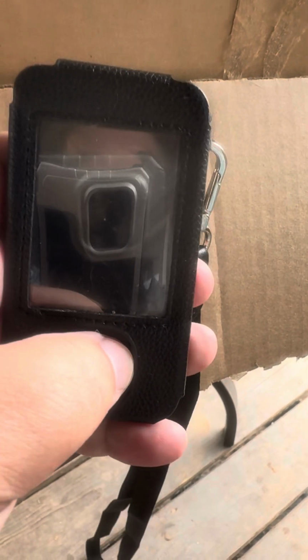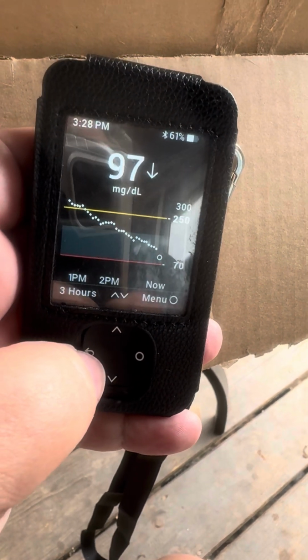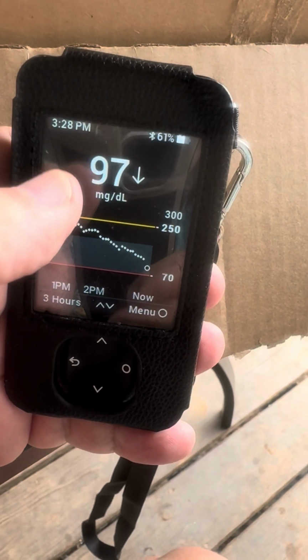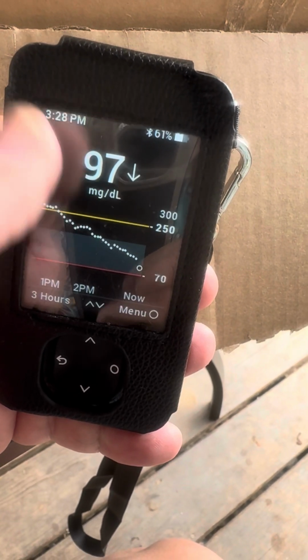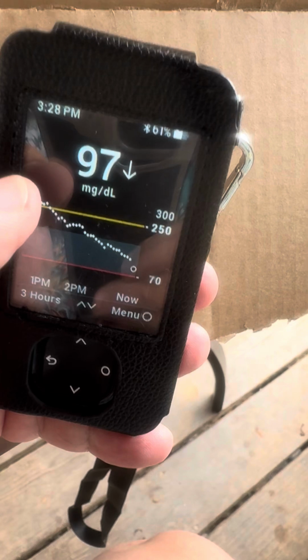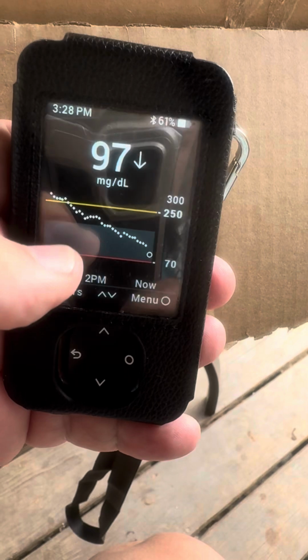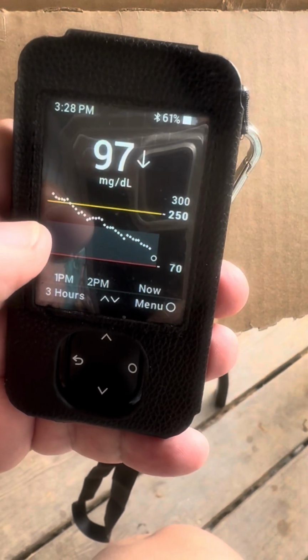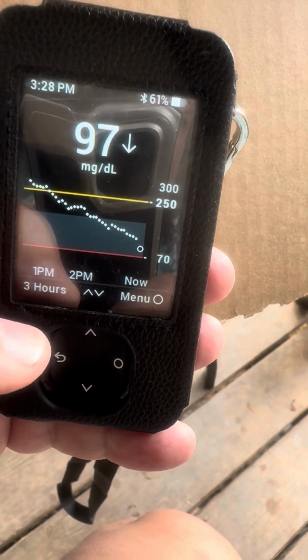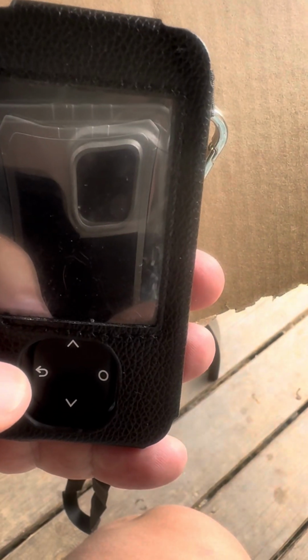I'm going to show the number on it that's currently on it. It's still coming down from lunch. See the down arrow? It tells you what direction it's heading. It has alarms for high, low, if it's going fast, high, fast, low. It has all kinds of alarms and arrows and warnings. Anything under 100 is awesome. It has an alarm for medical need, immediate, because I drop super low, super fast.